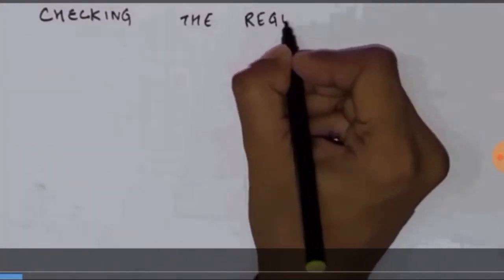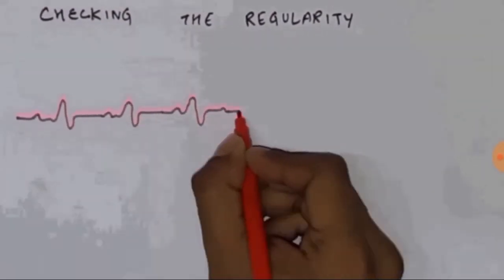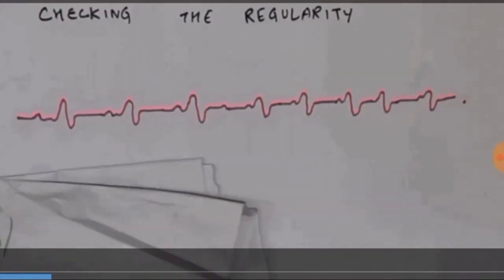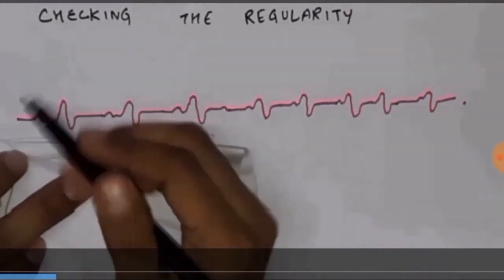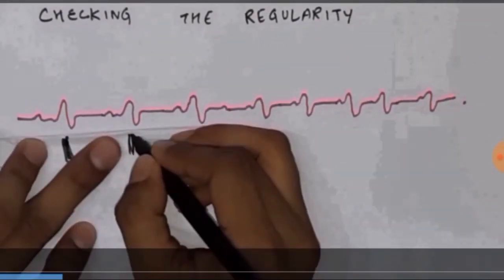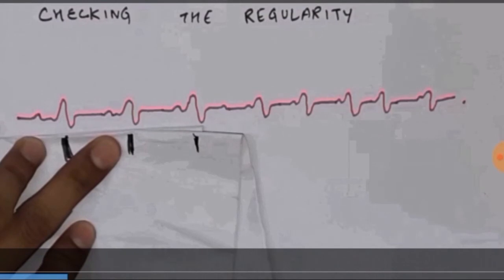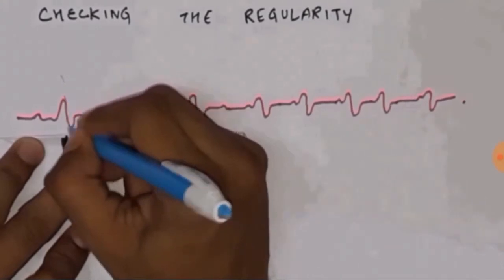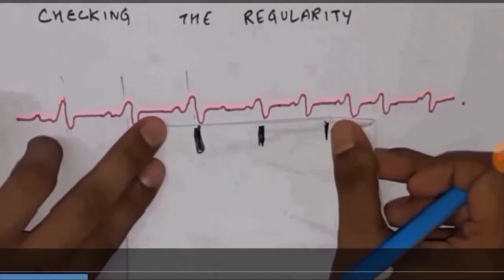Let us try to understand. First, we are going to check the regularity. So, how are we going to do that? Let us take an ECG as an example. We are going to take a paper and mark with a marker corresponding to every QRS complex. And we are going to move this piece of paper like this.